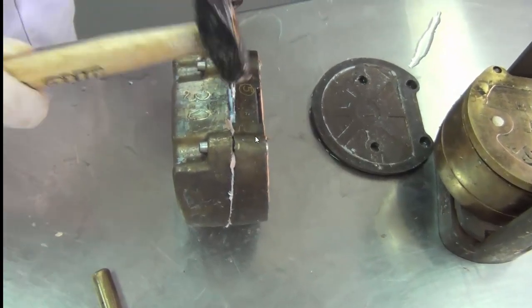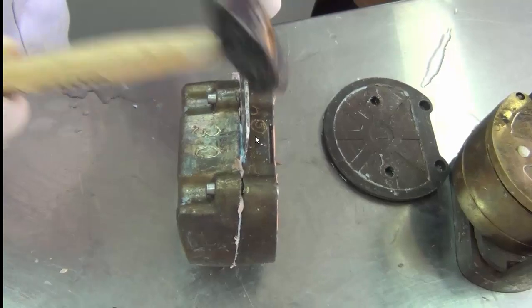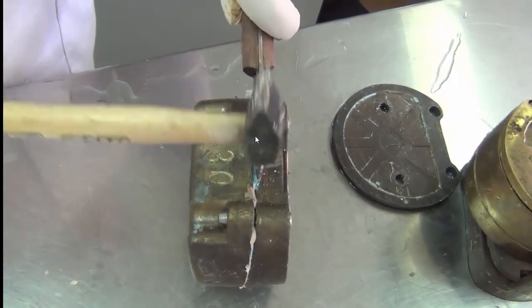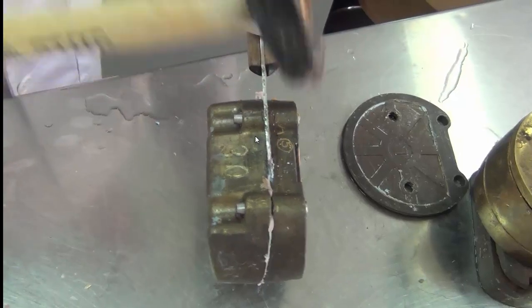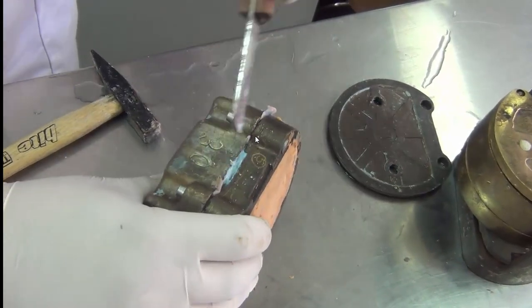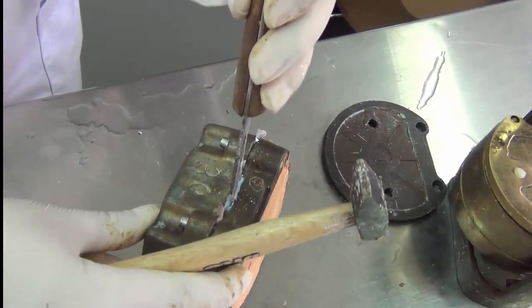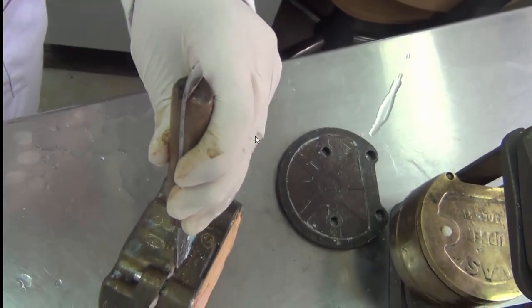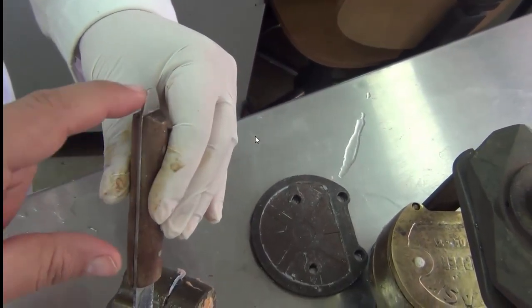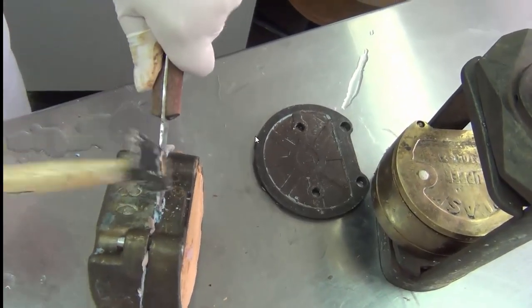Okay, so this is where we begin hammering. This hammering produces impact forces on the denture, and this is why we try to hammer in a controlled manner. So it's not severe hammering, it's controlled. We are trying to control our forces. Once the plaster knife is entered, we try to wedge it out, like a lever action. And the plaster knife is designed on the other end to have the metal exposed for the hammering. So that's why we prefer using the plaster knife, not the wax knife or any other knife for this purpose.